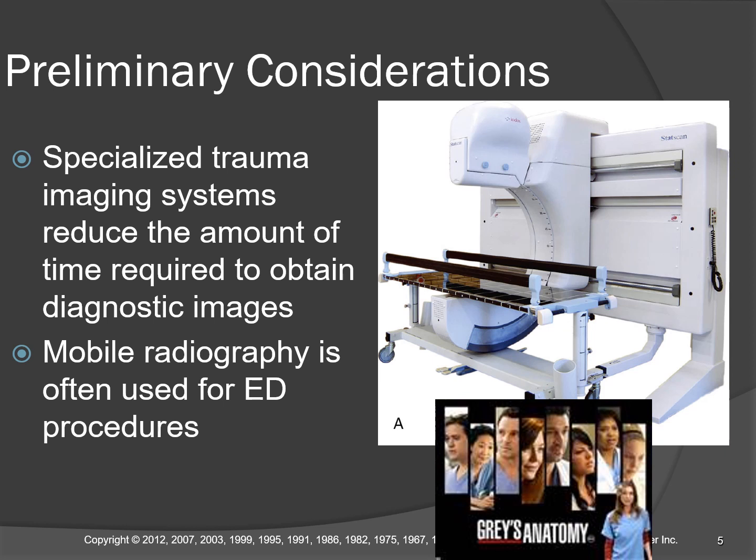It was invented for military hospitals just off the battlefield and Navy ships, where an injured soldier could be placed on a radiolucent gurney, and a C-arm could slide a fan beam from his feet to his head in 10 seconds and take an entire body AP view, then twist to a lateral and slide back from head to feet, and 10 seconds later you get a full body lateral. So a full body AP and lateral inside 20 seconds.